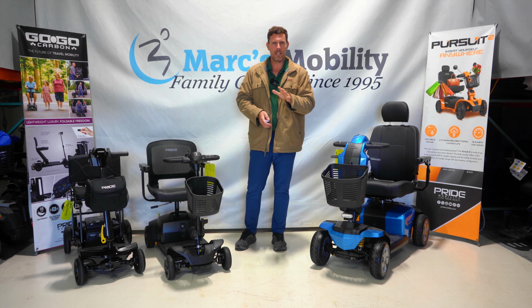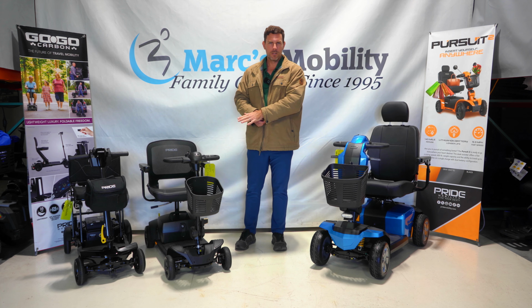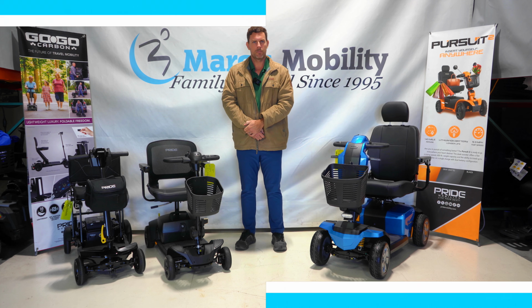But I do want to mention that if you are trying to get one that is going to fly, once again, just consider that those are going to have a little bit smaller drive range than some of these full-size lithium or full-size scooters that can get up to approximately a 40-mile drive range.